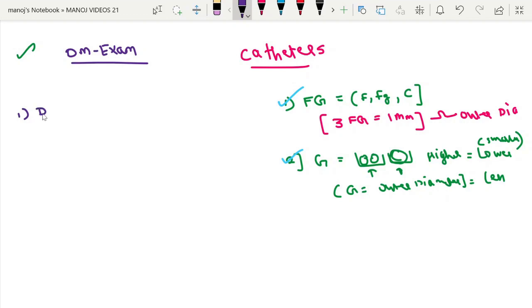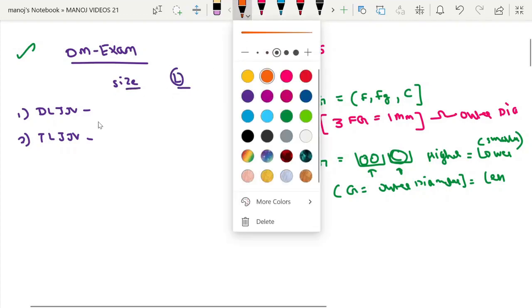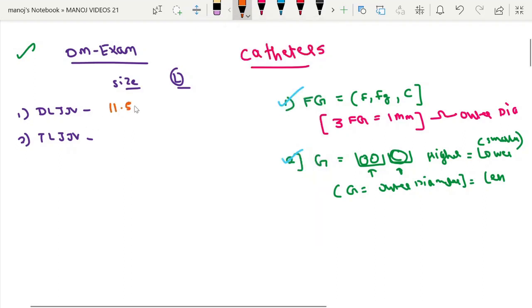First is the double lumen IJV catheter. Second, we will see the diameter and French gauge of the triple lumen IJV catheter. For the double lumen IJV catheter, the size is 11.5 French and the length is 13.5 centimeter. For the triple lumen IJV catheter, it is 12 French, length is the same 13.5 cm.